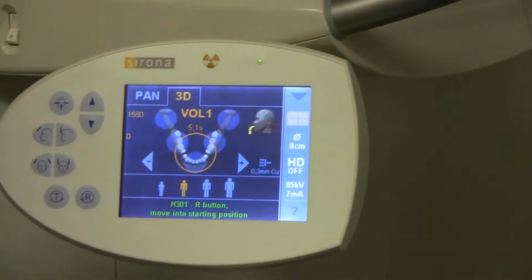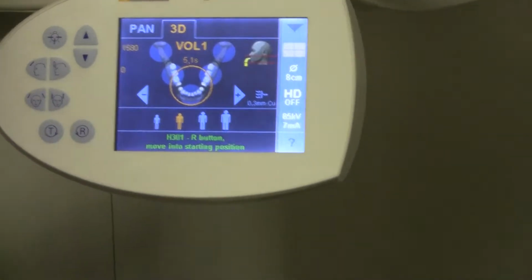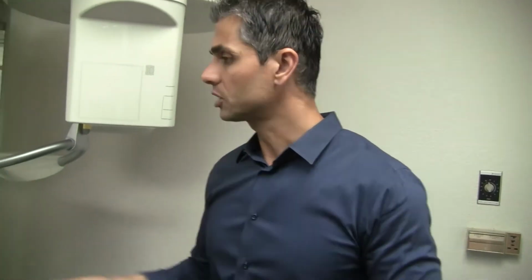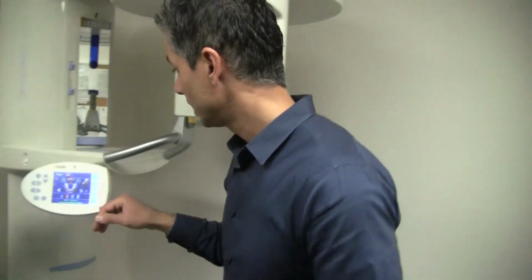What it shows here, you have a circle right here, or a circle right here, or a circle right here, and same thing here on the other side. But it's either or. Like if you're doing it on the left side, it's only the left side. If you only do it on the left side, it'll show you the patient's left side only. Okay. And I'll show you an example. When we take this one, you kind of get an idea what it looks like.